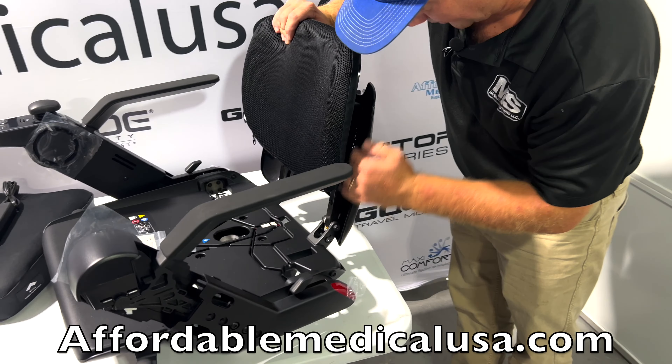With that being said, if it's too much for someone to come to the back and charge this up — depending on the person, they might not be able to bend over — most power chairs can charge through the joystick. We have a way of charging up here. We'll have that on our spec page — it's a cord that runs back there so you can plug it up front. You also have little lights back here to add some character if you're out at night. No lights on the front, but we do have lights we can put on if you want. Give us a call if you have any questions: 803-926-2224.